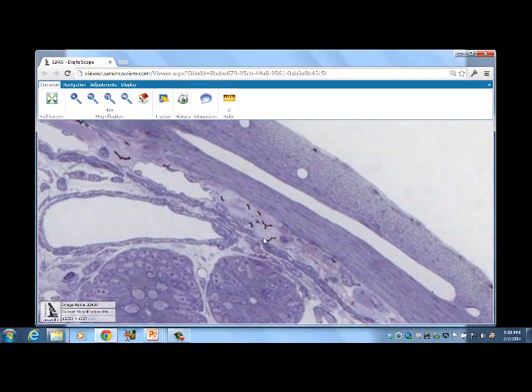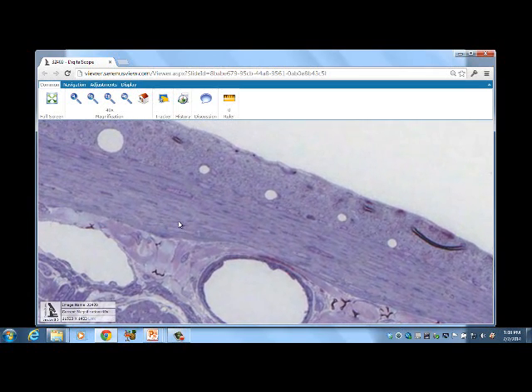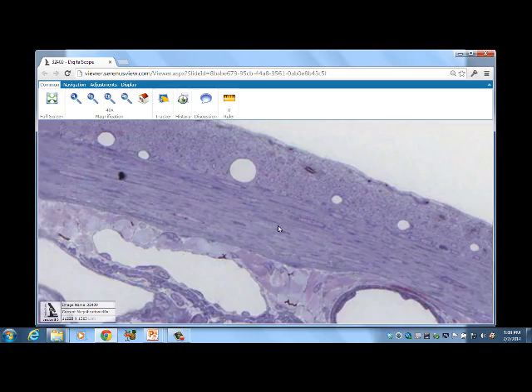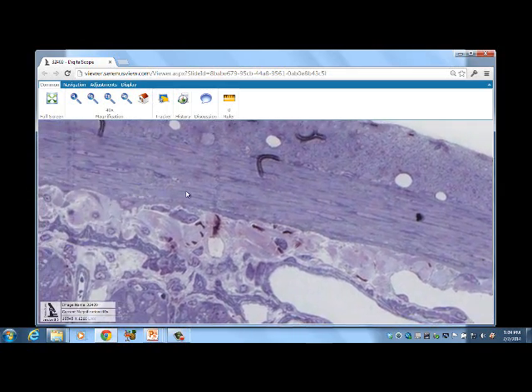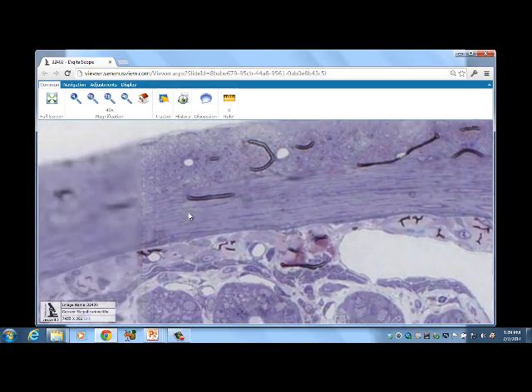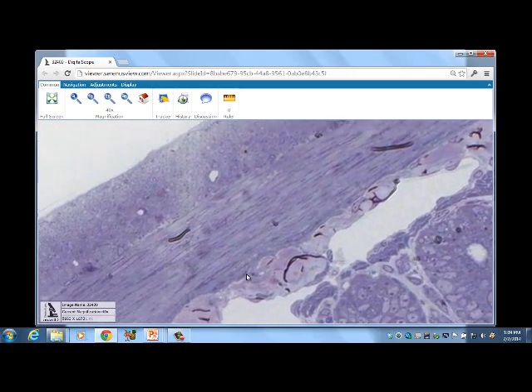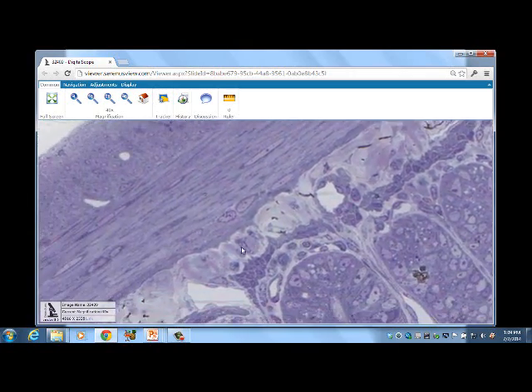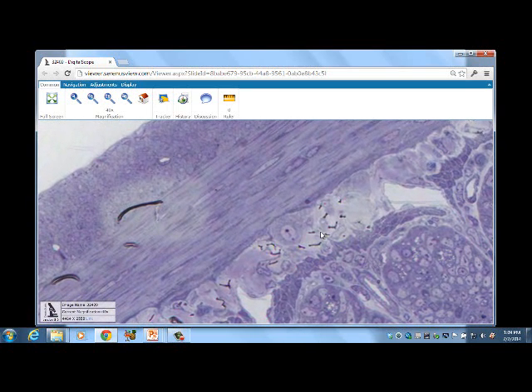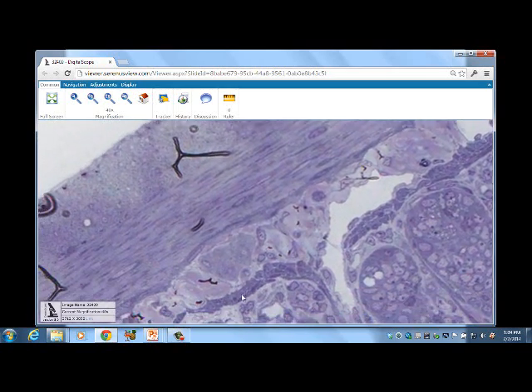But in addition to that, we have nerve cells, and the nerve cells in there are located in two places. Here we see smooth muscle cell. If we go around through here, we'll be able to see, this is some artifacts that we see there in the slide. But if you just look around, and this is what you have to do, you'll be able to see. And here's a nerve cell. This is a Nissl substance here. There's a nucleus and a nucleolus. There's a big nerve cell of the Meissner's plexus, which is located in the submucosa.